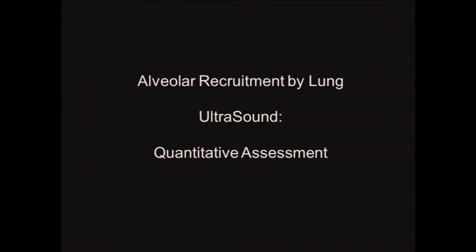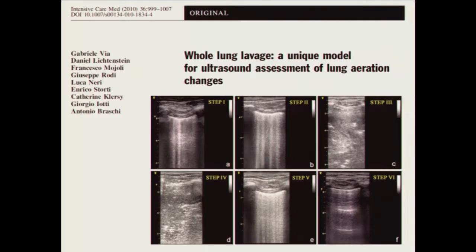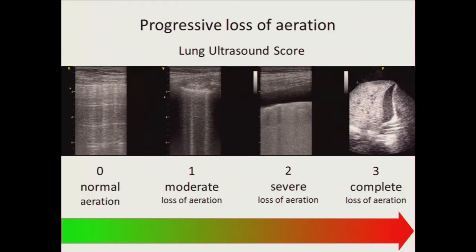The second part of my presentation is about the quantitative or semi-quantitative assessment of lung aeration. You know that we can track the change of lung aeration by ultrasound.